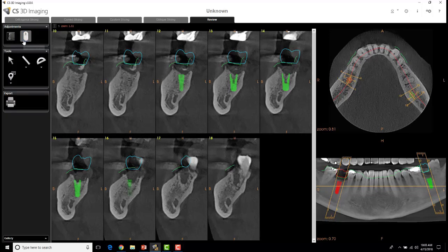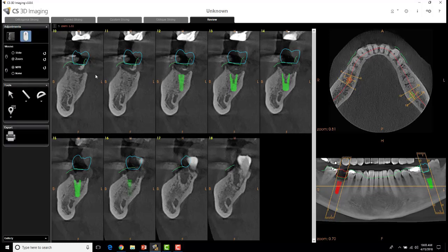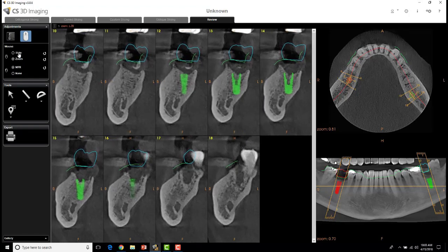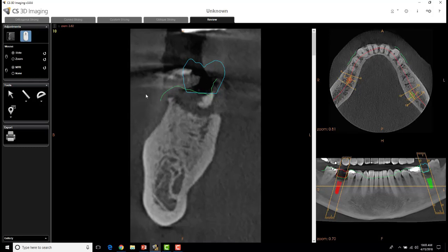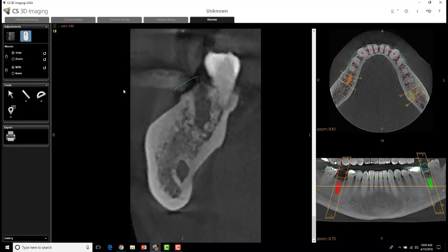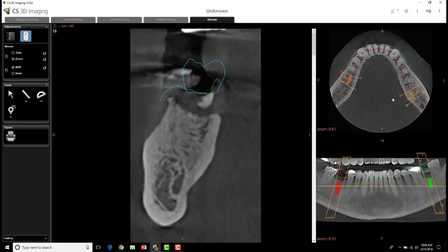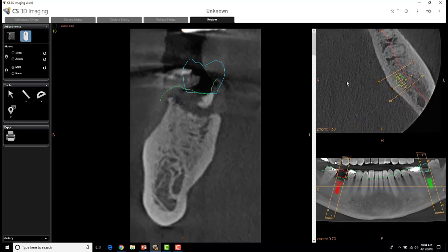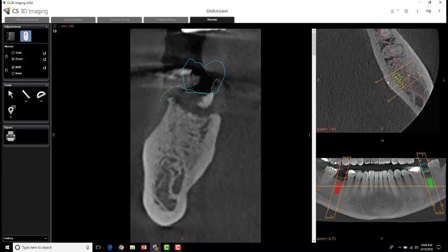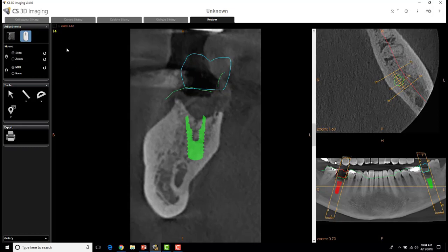We can do a few different things. One is we can change from slide to zoom — I can zoom in on each of these slices if I wanted to — then change it back to slide. I can look at all nine slices in one view, or I can change this to one and use my mouse wheel to scroll through each of those nine slices. Each slice is changing as I scroll, and if you zoom in on the implant you can actually see the numbers and which slice you're looking at. So as I scroll through I'm looking at slice 14, and I can identify where that slice is located. It gives you some really nice orientations with all of these views.